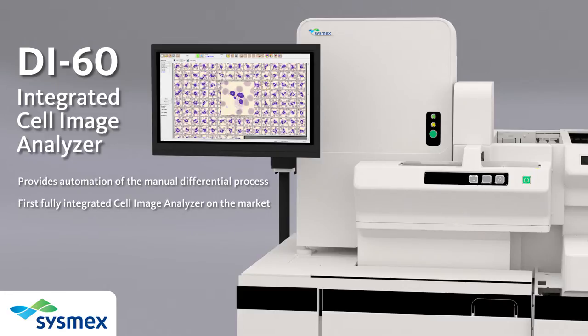Automated cell image analysis promotes a more standardized differential result and streamlines collaboration and consultation through extensive network connectivity and real-time access to patient cell images.